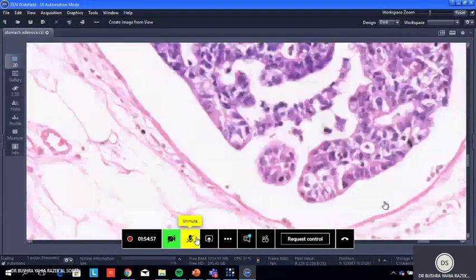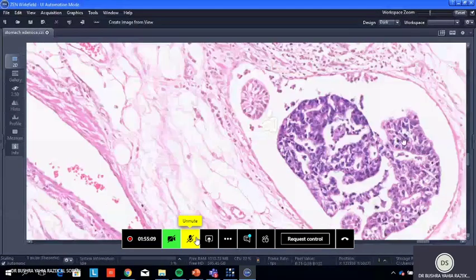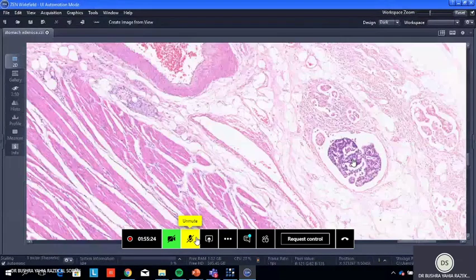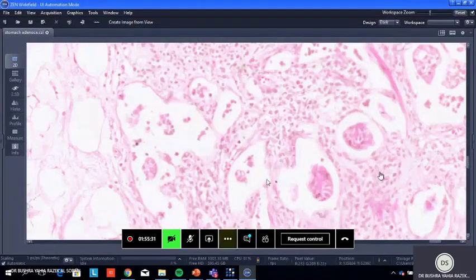Can you see the lymphatic? This is the wall. Usually in the lymph, we cannot see any blood vessel or RBC or anything. We just see it is clear. But here it is already invaded by malignant cells. Any question? Also, this one is tumor emboli there.